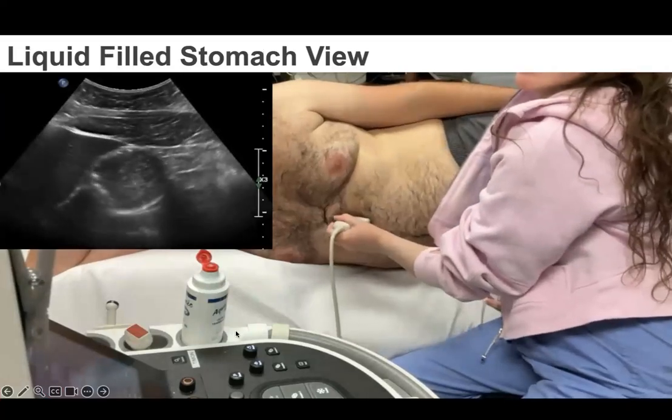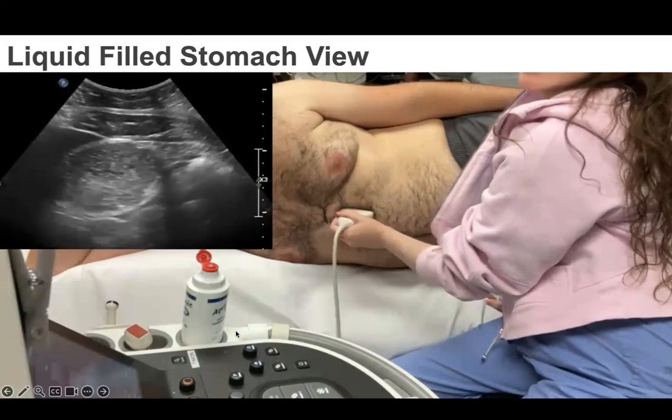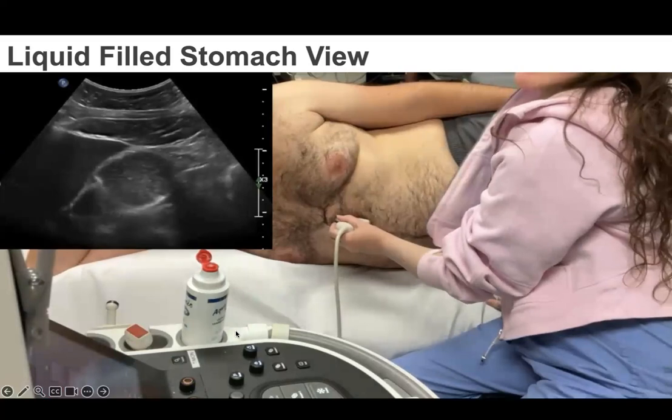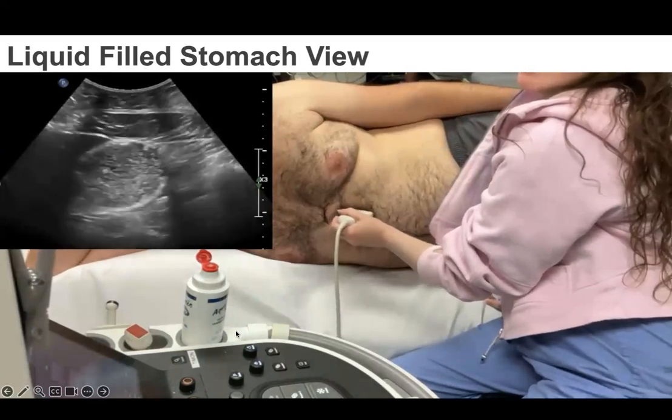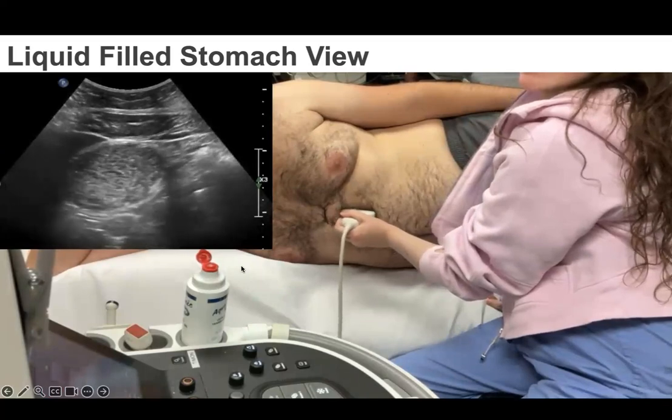Clear fluids will appear anechoic. If fluid was recently consumed like the model had done, hyperechoic air bubbles will be present, creating the starry night appearance demonstrated here. If clear liquids are found, the cross-sectional area should be obtained and gastric volume should be calculated.